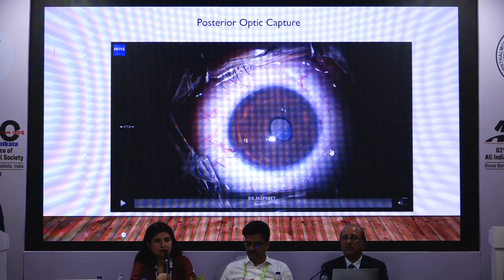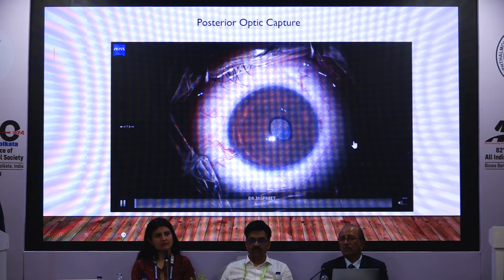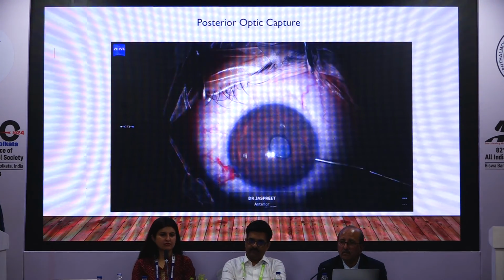So I'll just take you through this procedure. This is a little older child, and we haven't put any dilators, and you can see we were just discussing the intracameral dilators.